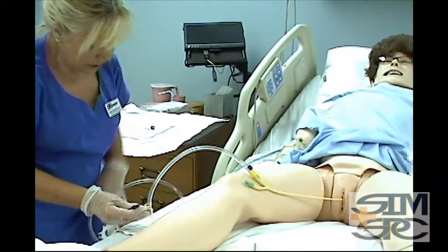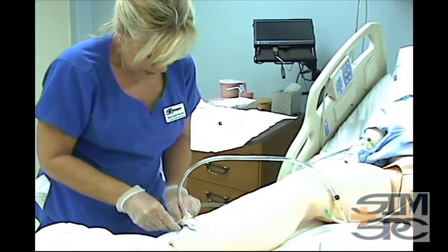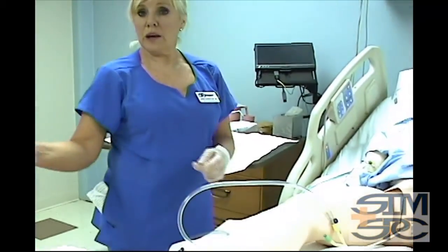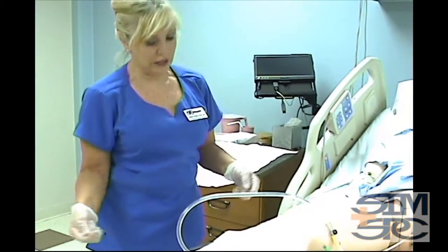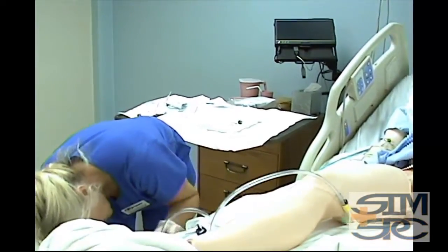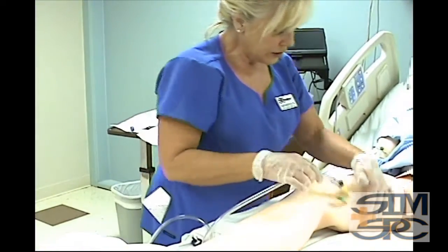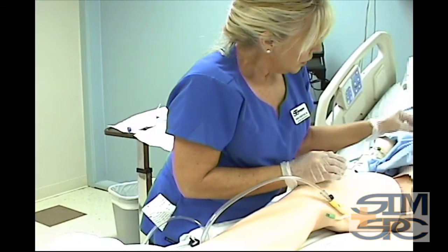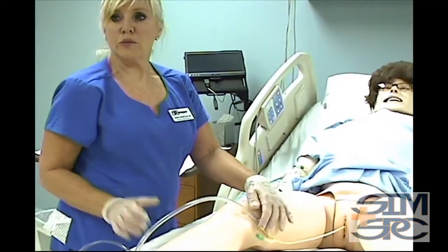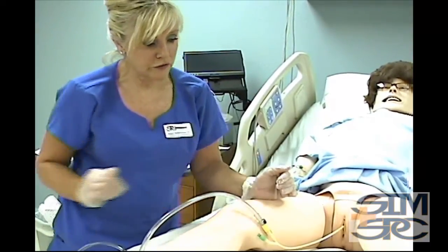Don't ever hang the bag to the sidewall. Always hang it. And I don't ever hang it to the draw sheet, because if somebody's not careful and they come, they can pull and use the draw sheet and pull the catheter. So you want to hang it to the bed frame itself. Don't ever leave one on the floor. Don't lay it on the floor. Like I said, secure it. Also, on the patient, don't ever keep the bag above the bladder, because it will go back into the urine, go back into the bladder, and that can cause a source of infection.